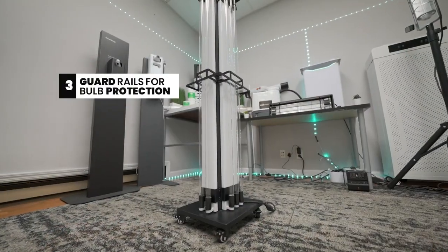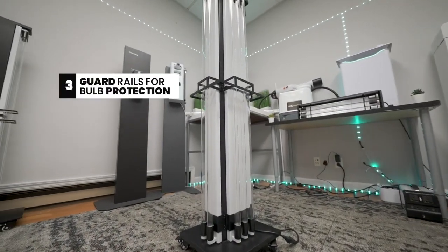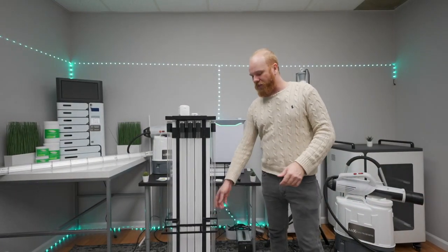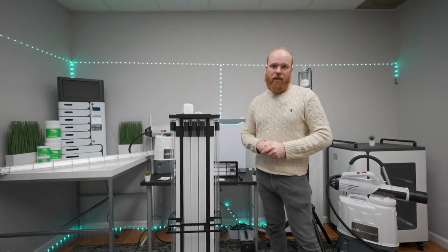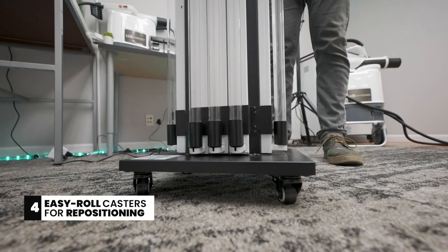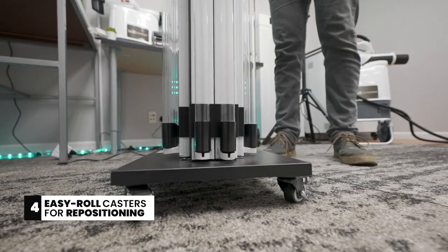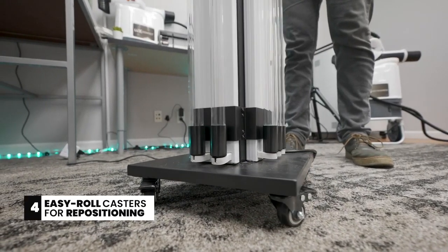The central guardrail here ensures that the UVC bulbs are protected from any accidental damage and allow for safe maneuvering and handling. The device also comes with four EZ-Lock and EZ-Roll casters, which allow you to easily reposition the device according to whatever space you choose to disinfect.